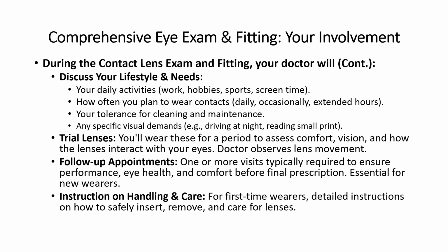One or more follow-up appointments are typically required to ensure the lenses are performing well, your eyes are healthy, and you're comfortable before a final prescription is issued, especially for new wearers. And for first-time wearers, the doctor or their staff will provide detailed instructions on how to safely insert, remove, and care for your contact lenses.